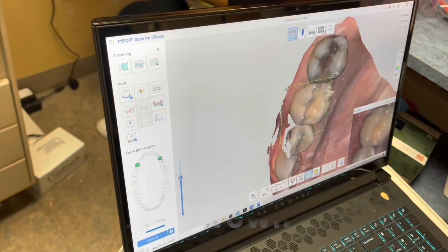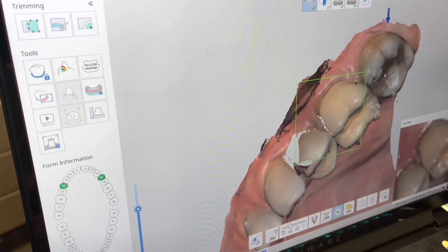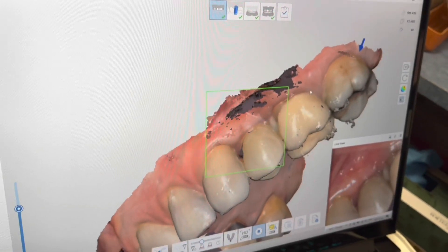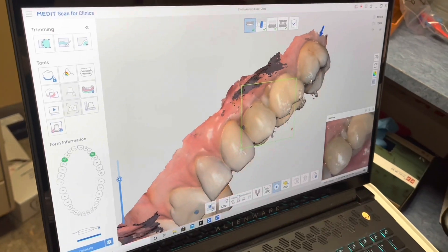We've actually used this scan three times — we did this for planning the implants and getting a template, then we scanned the implants again to pick up the impression using the intraoral healing scan abutments. And now we're scanning the crowns which will be put into place.